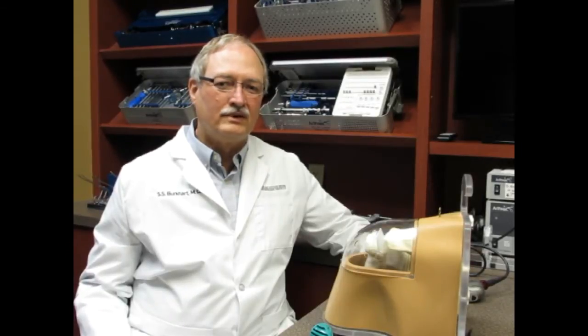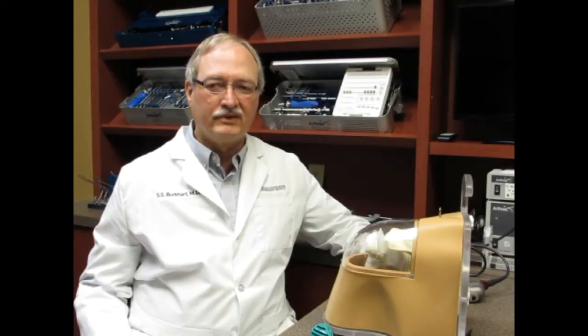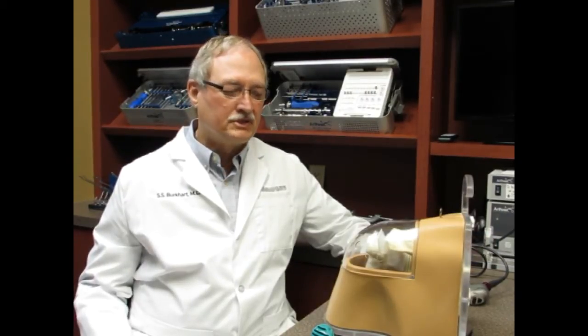I'm Steve Burkhardt, and I'm one of the orthopedic surgeons with the San Antonio Orthopedic Group. My specialty is shoulder, and most of what I do is minimally invasive arthroscopic shoulder surgery. This is something that's been a huge benefit that's developed over the last 25 to 30 years, just very gradually in stages, and I want to show you a little bit about what that is and what it has to offer.